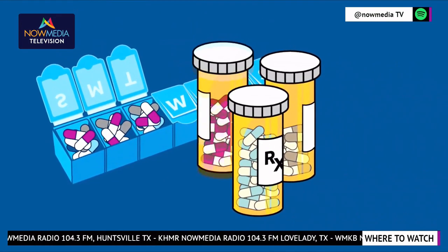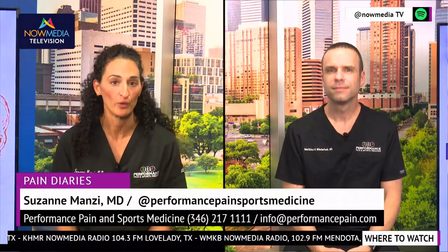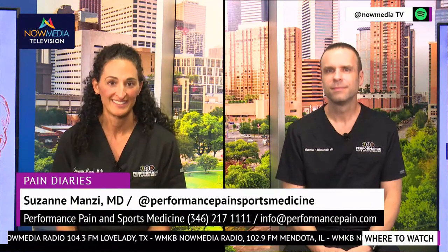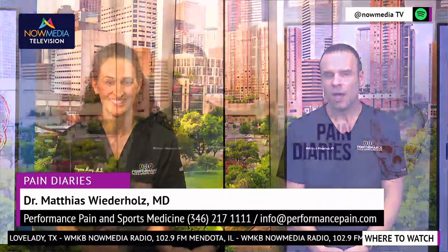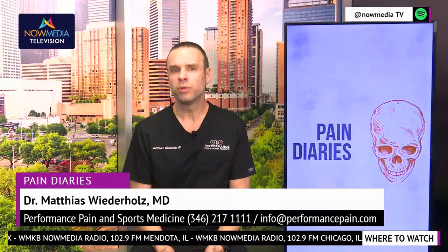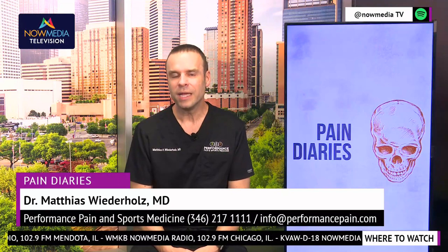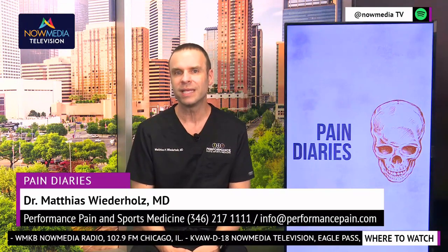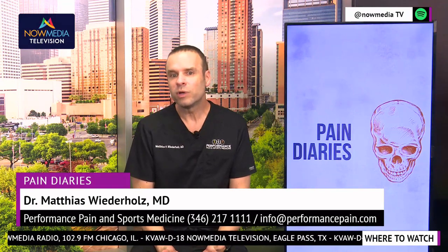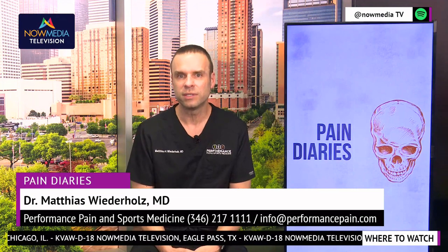No, for sure. Patients love that they have the full control over it. So let's go over some of the potential benefits as well as risks associated with using spinal cord stimulation. Well, benefits are pretty obvious, right? You get pain relief. I think that's what most people that suffer with chronic pain are looking for. You're trying to get relief of your pain, and you're trying to do that without the side effects and the stigma that come with medications. So then let's focus on the potential risks. Why would you consider not doing this therapy?